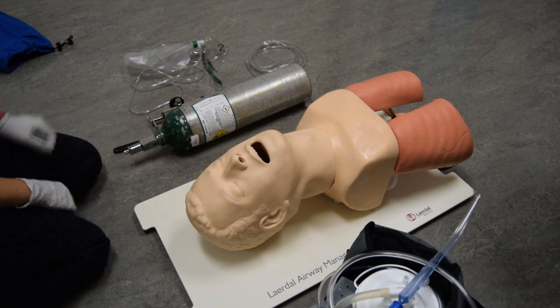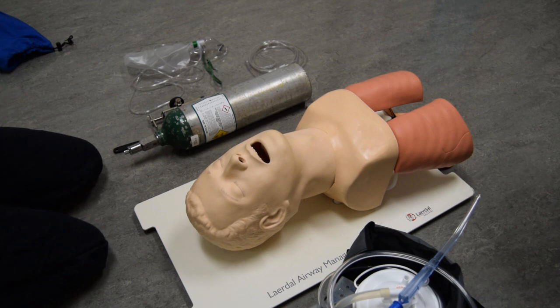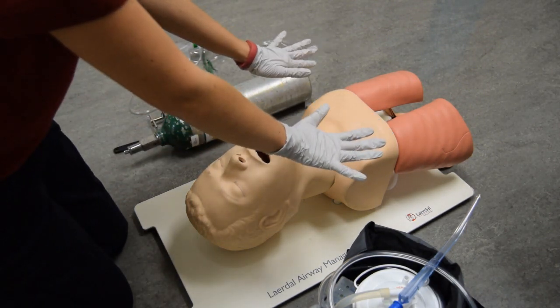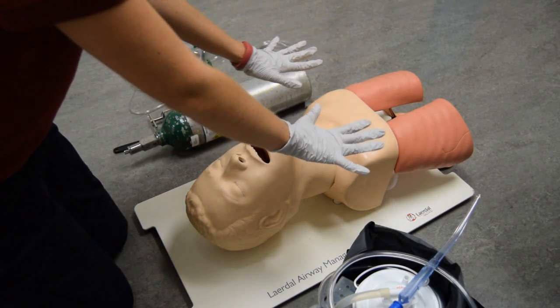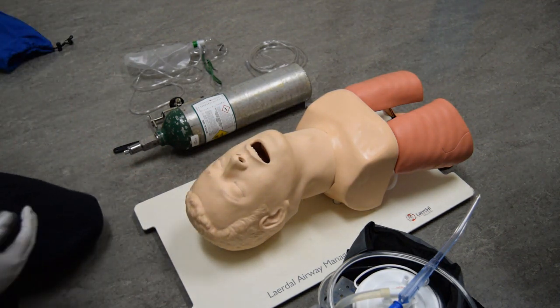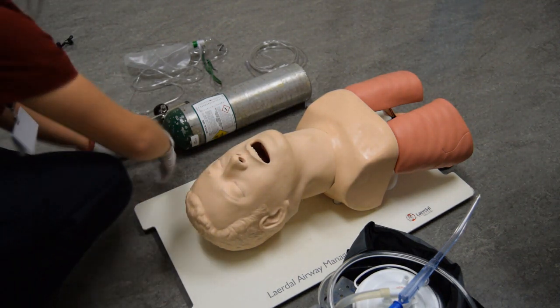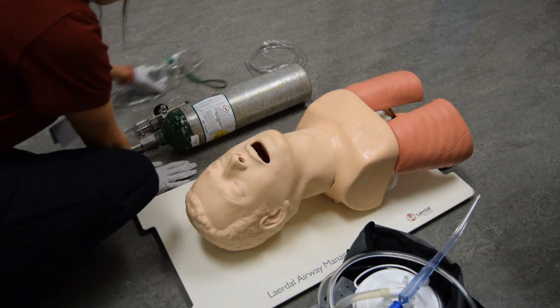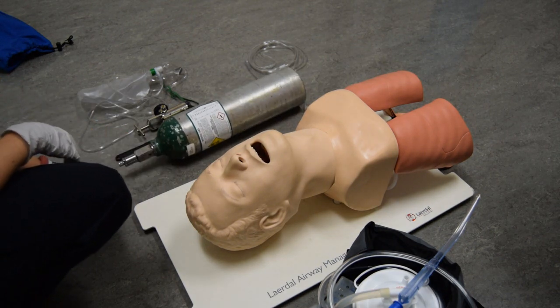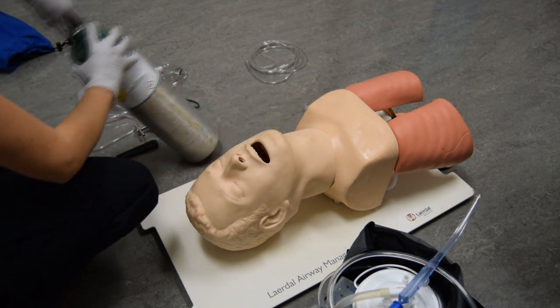Takes or verbalizes appropriate body substance isolation precautions. Scene safety, BSI. Gathers appropriate equipment. Cracks valve on the oxygen tank.